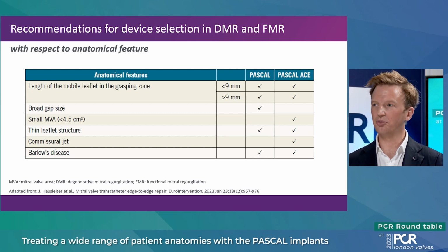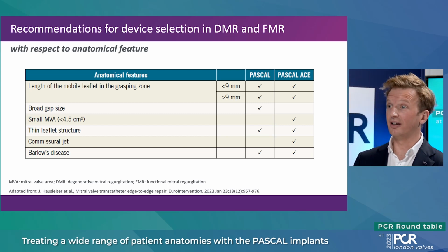So perhaps starting with you, Niklas, we've seen Jörg's views on device selection and how to tailor it to the patient's individual anatomy. What is your perspective on that? Well, I definitely think that both PASCAL devices enable us to treat multiple mitral valve anatomies, and so I completely agree with that.